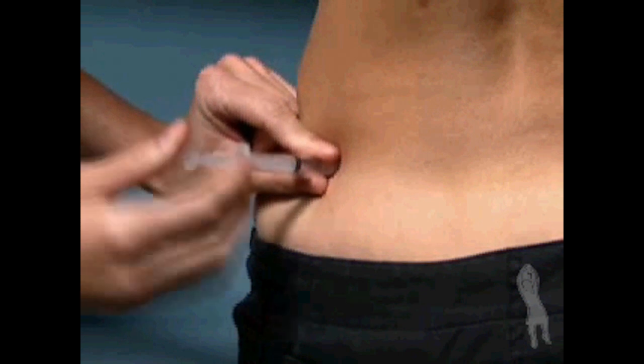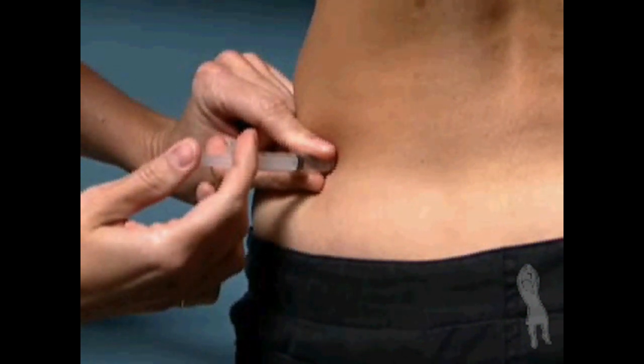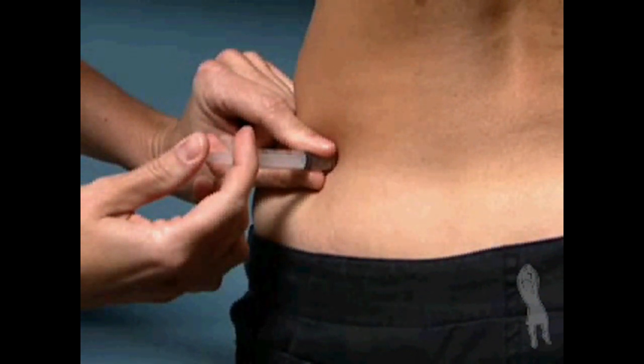Hold the barrel of the syringe with your non-dominant hand and very gently pull back on the plunger just a bit to check for blood. Do not pull forcefully back on the plunger. If there is no blood, push the plunger in a slow, steady motion until all the medication is injected. If there is blood in the syringe, remove the needle, change the needle, and start the injection again at a different injection site.